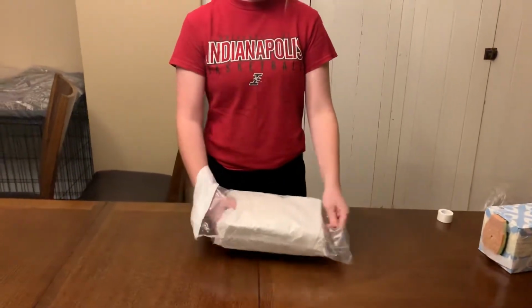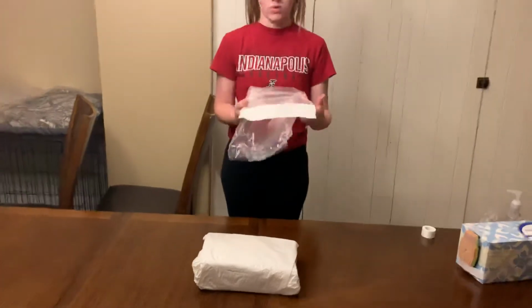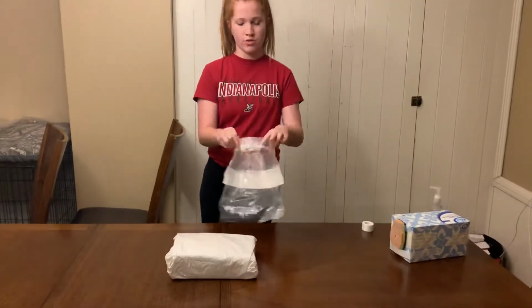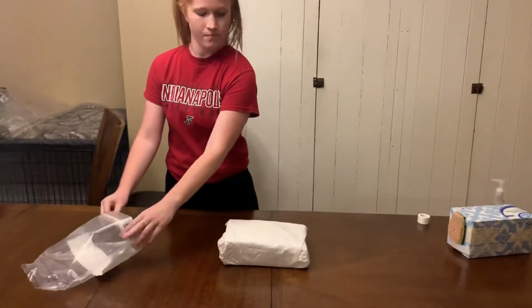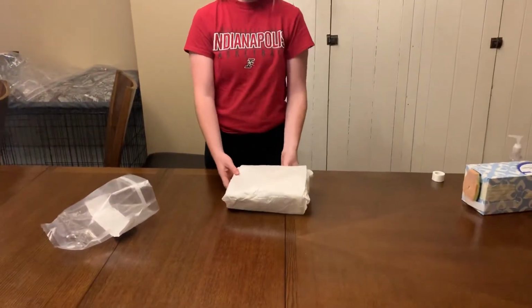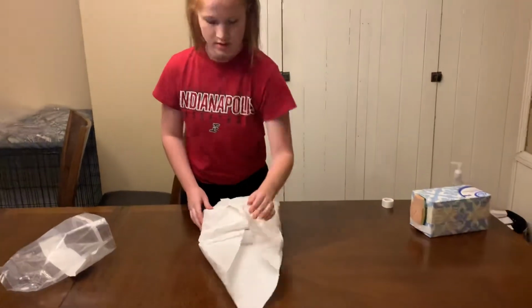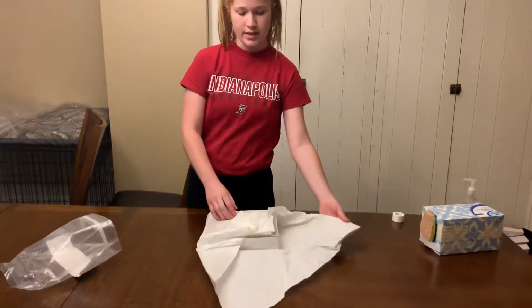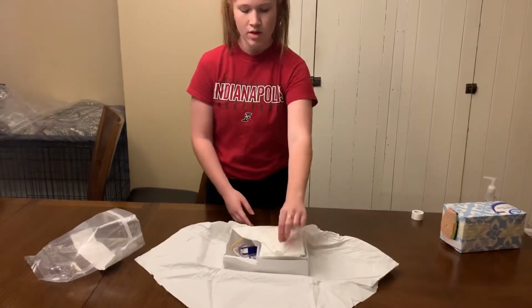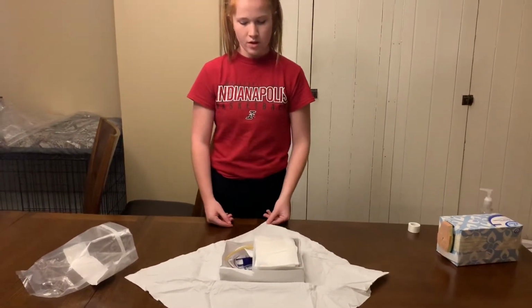I'll open the bag and take out my kit. I'm going to open this plastic bag to put my trash in. Okay. So to open this sterilely, I'm going to open it with the top flap first. I will then open the sides. Push that up a little bit. And then I'm going to take my bottom flap back towards me.